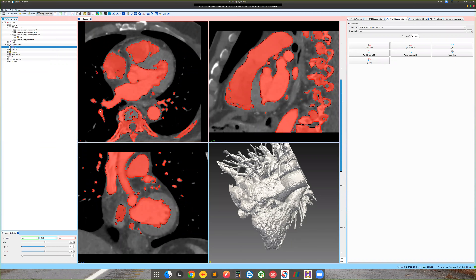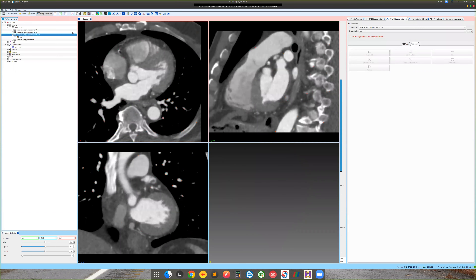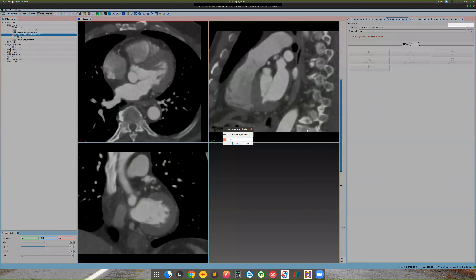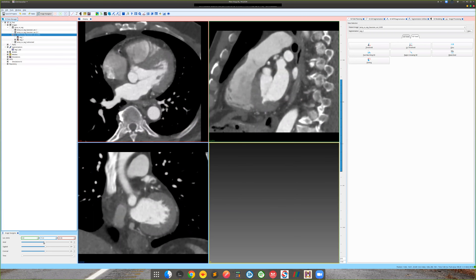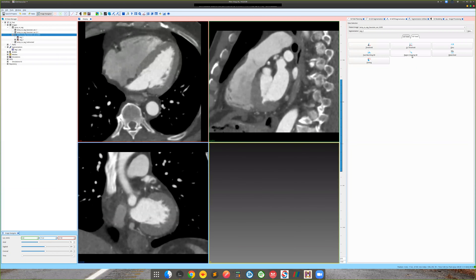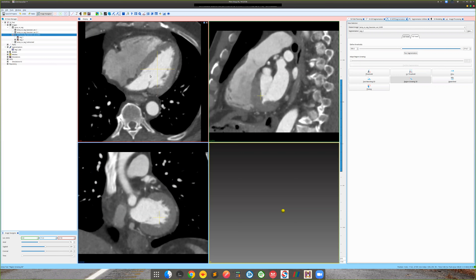Let's refine the segmentation by changing the thresholding. Take the filtered image and create a new segmentation with a slightly higher threshold. Deselect the previous segmentation so it doesn't appear. Navigate to the left ventricular cavity, select Region Growing, choose a seed point, and change the lower threshold to about 500. That's well above the right ventricular region but still includes the left ventricular lumen. Set the maximum to the image maximum and run the segmentation.